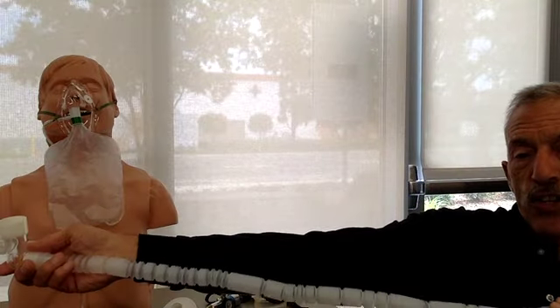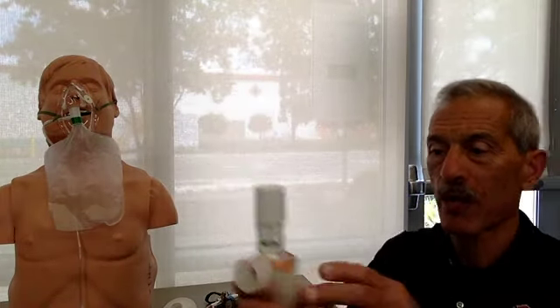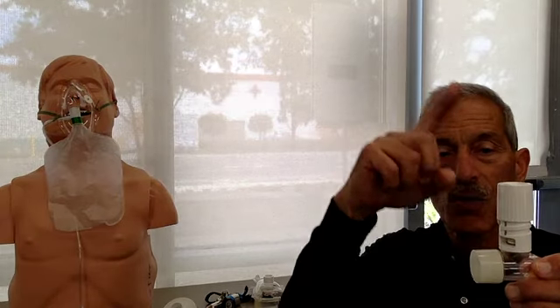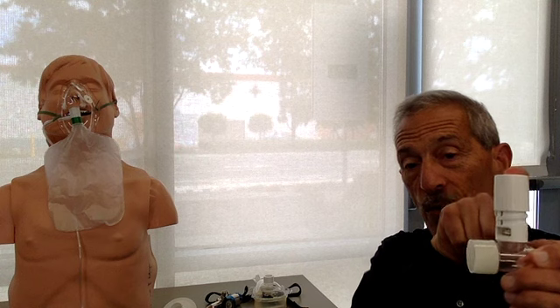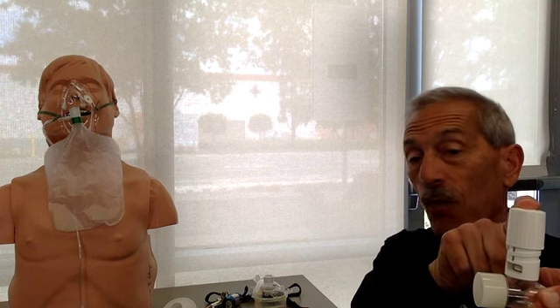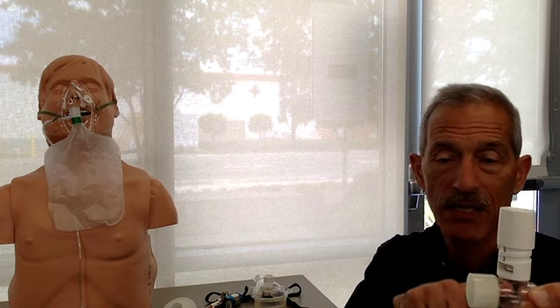Now, this tubing comes pretty short. You can stretch it out. It's got an accordion kind of setup there. So the pressure is flowing through here. It comes out the port right here where the mask is applied. There's a way of adjusting the amount of pressure the patient's receiving. This is measured in centimeters of water. It's 5, 7.5, and 10 centimeters of water.